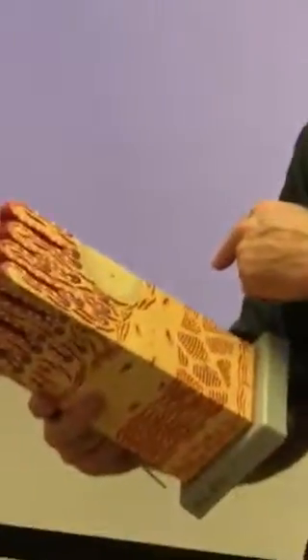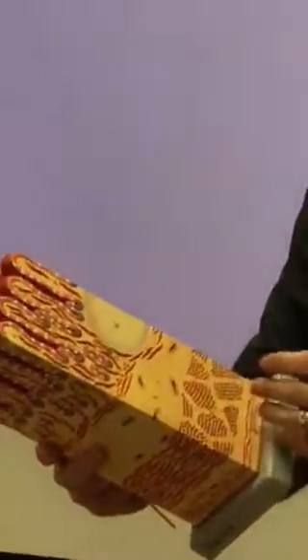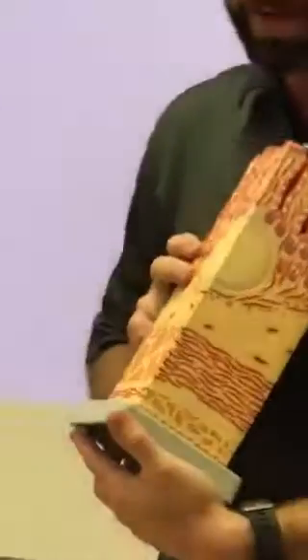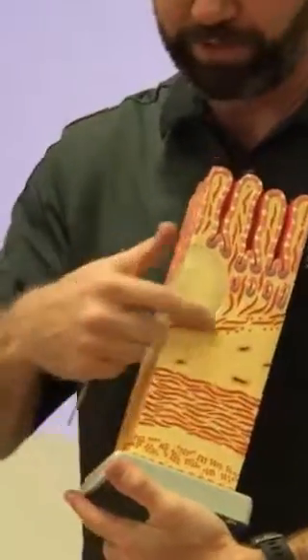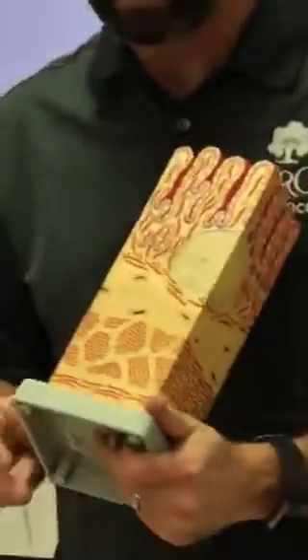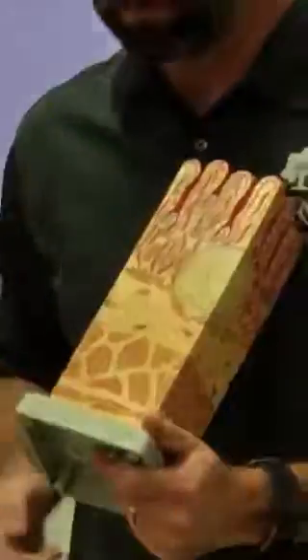So instead we have to look for something that you do find in abundance in the ileum that you don't see as much of in the jejunum, and that is Peyer's patches. Big groups, big clusters of follicles. So I think we can probably assume this is ileum. That's probably what they're trying to show here with this big follicle.